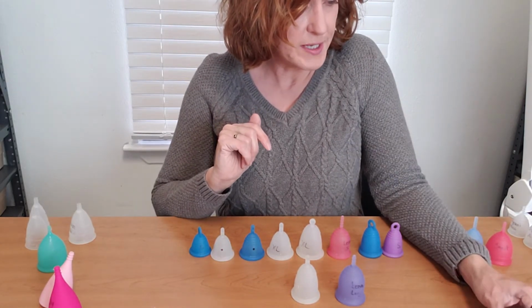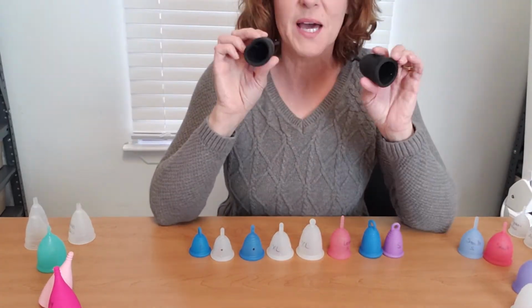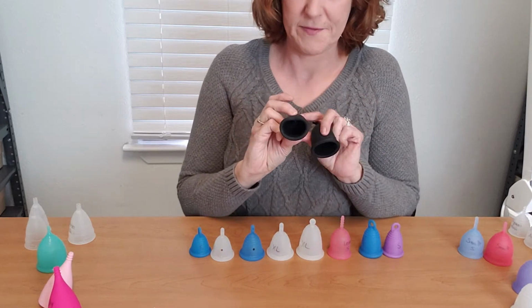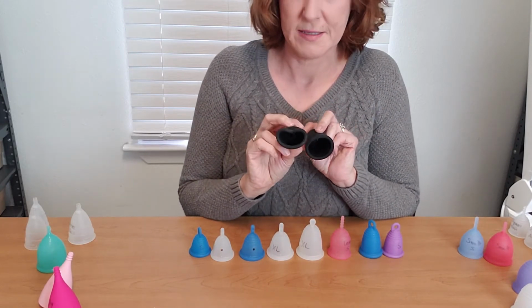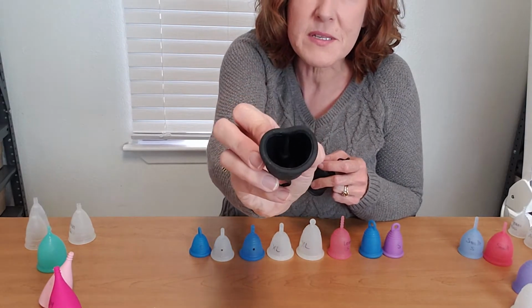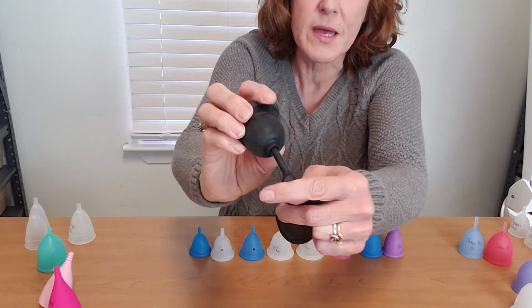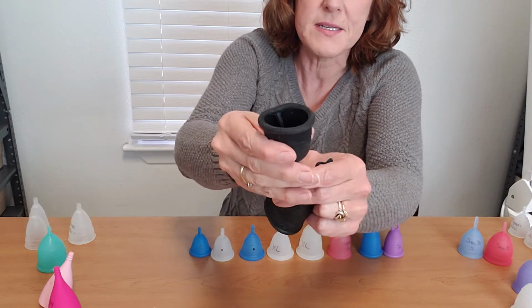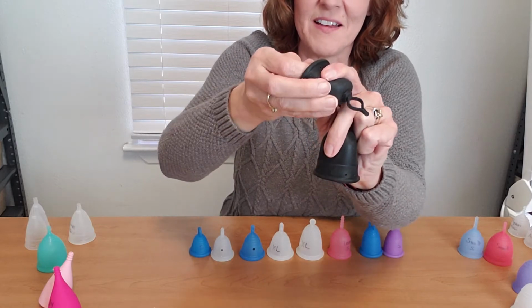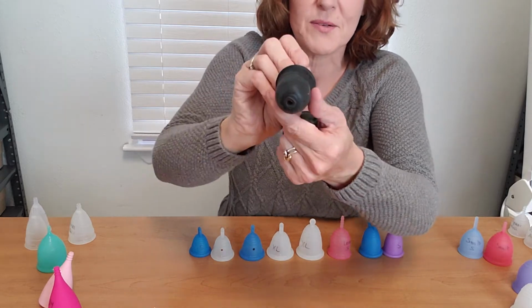Then here are some that we hear about frequently now, and they kind of recently popped up. It is super weird, I don't know if you can see these. They have adjustable length handles, but the handle that's left over is in the cup itself, so it kind of deforms the cup and creates a hole on the bottom. And the idea, I guess, is that you can shove it back up here and then have less of a handle sticking out. Of course, oops, now I created a hole because I pulled the whole thing out.